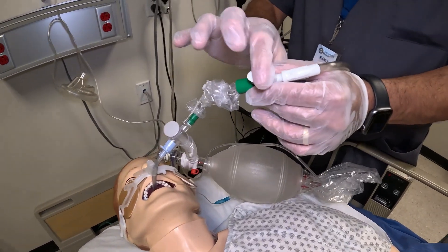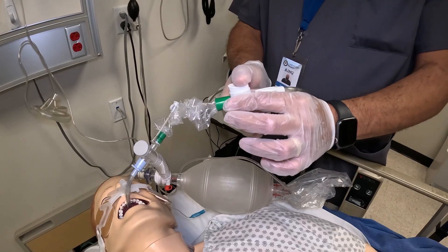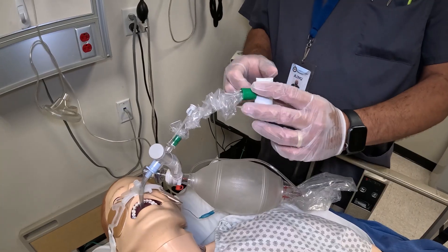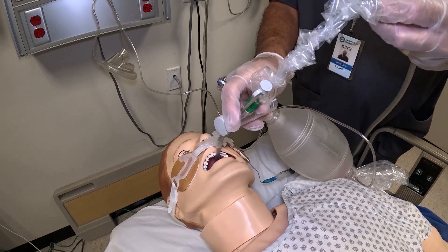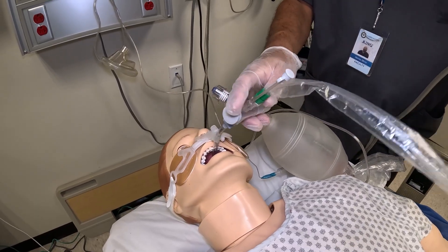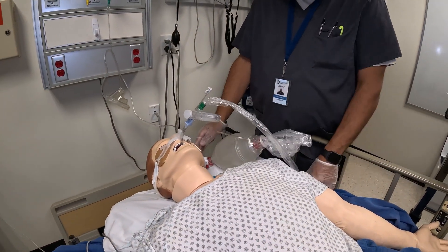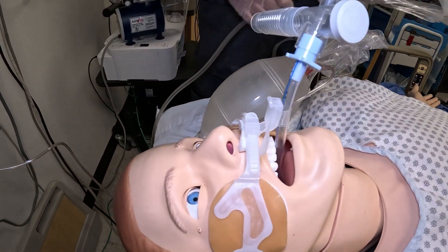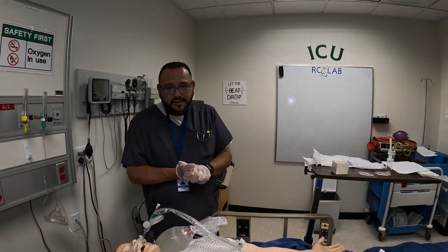This Ballard has a locking mechanism — you can turn it to allow the catheter to go down, or turn it so it will not go down. The importance of that is if the patient were to land on it, it could push the catheter in and continuously suction, taking a breath away from the patient — we wouldn't want that. Go ahead and suction on the way out, making sure you are securing the tube with your hand so it's not pulling on the patient. The nice thing about this is you can leave it in-line and it's still clean because it has a sheath over it. Leave it hooked up to your suction, make sure you lock it, clean up your area, document what you have, and that is all. Thank you.